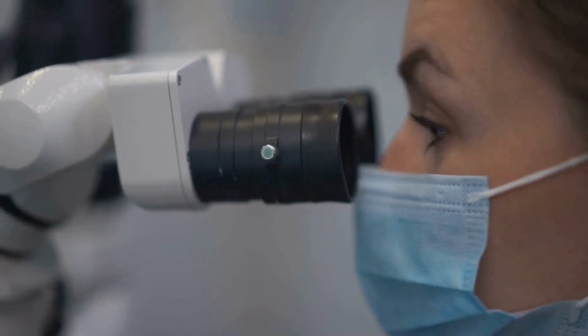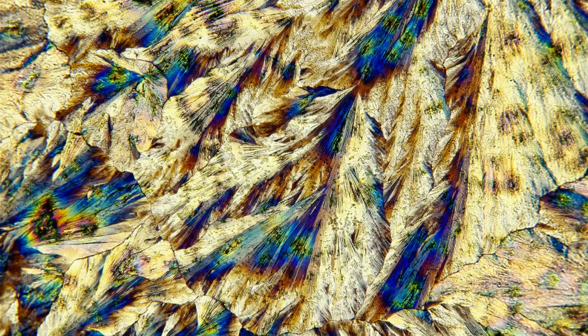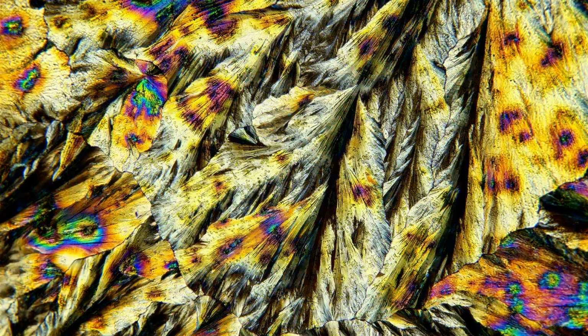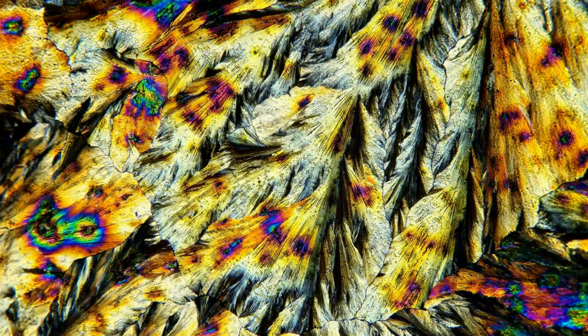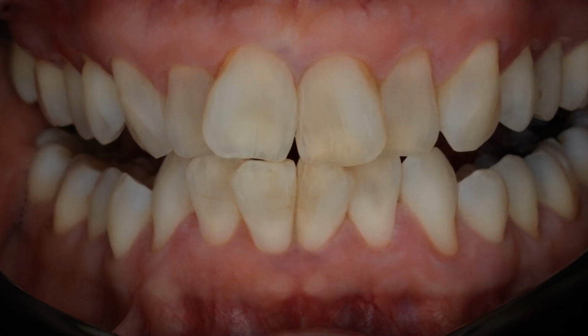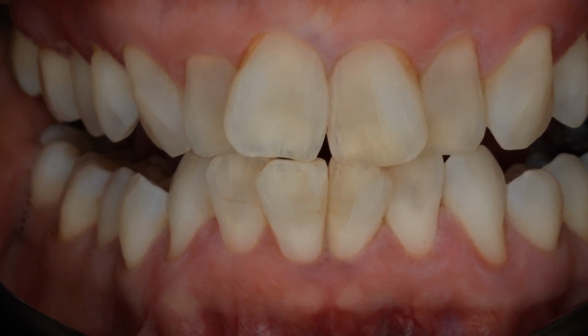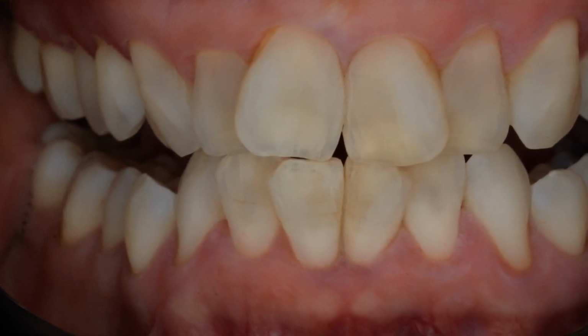In various fields, from photography to microscopy, the application of cross-polarized light has revolutionized the way we visualize and understand our subjects. This technique, which involves using polarized light to selectively filter out unwanted reflections and glare, offers a unique perspective that unveils hidden details and enhances clarity.